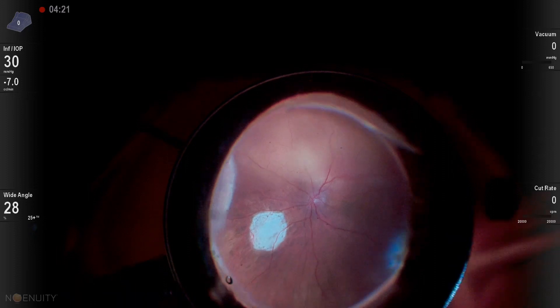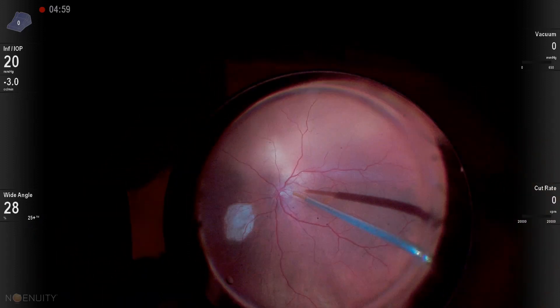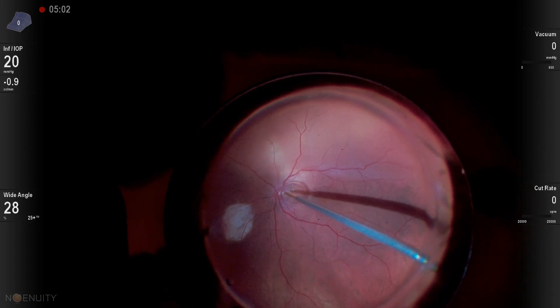Here we're going to start to depress more nasally, supernasally. There you can see that posterior draining retinotomy scar. And now we're going to put perfluoron in the eye.